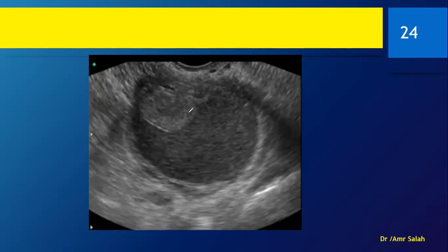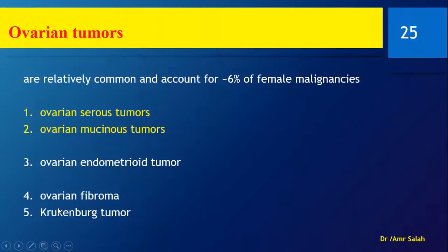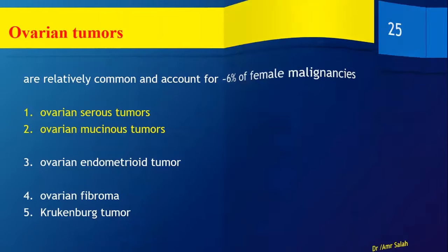Here is another lesion that looks like an endometrioma, but it does have vascularity inside.